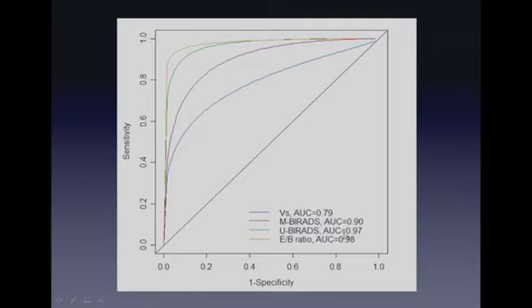And as we'll discuss later, the area under the curve here was 0.98, but it turned out that 2 of the cancers that we had in the series were actually lymphomas, which are truly soft cancers. So in those, elastography actually was correct, but it counts against us because we were considering only hard lesions as cancers. And if we would have eliminated the lymphomas and looked at our data as only primary breast cancers, the area under the curve for the strain would have been 0.99. I'm sorry, it actually would have been 1.00.